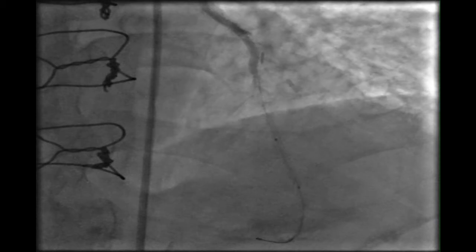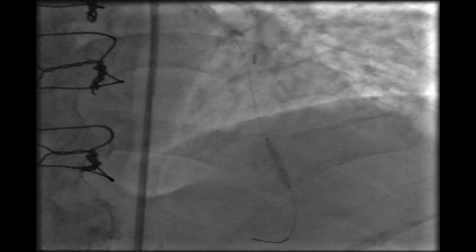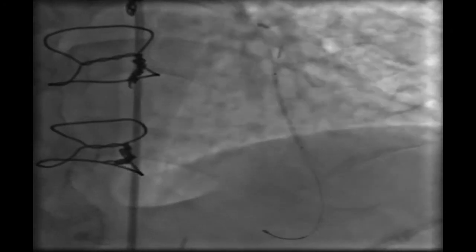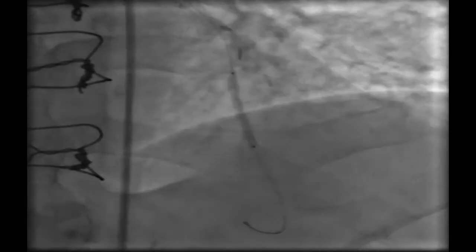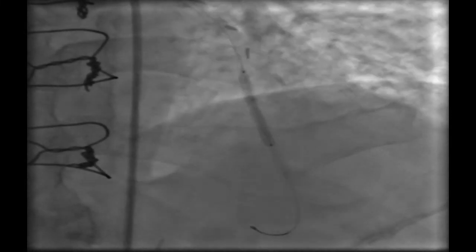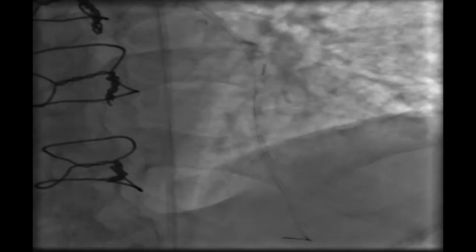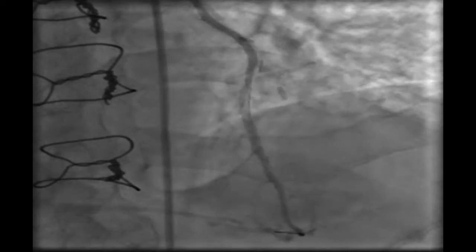Here we can see the proximal lesion after deploying the distal stent. Then we deployed the proximal stent, 2.5 mm in diameter. And this is the final result of the LIMA-LAD, with no need to do anything more like POT or similar techniques.